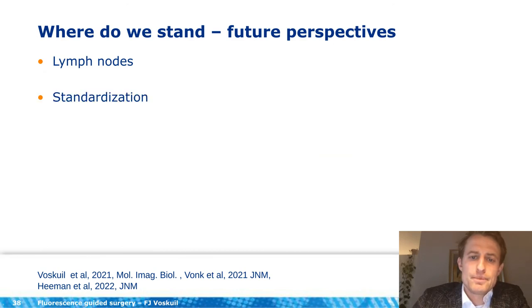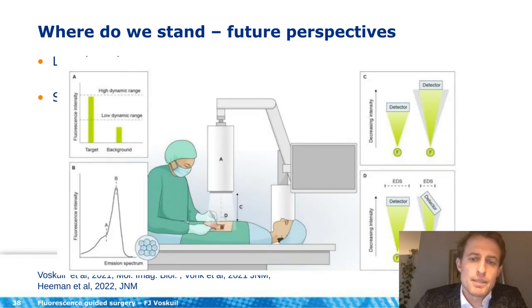We believe that standardization is key in our field. A nice paper to read on that is published by our colleague Heyman, also in the Journal of Nuclear Medicine. We know that the imaging results are largely influenced by the most stupid things, like the distance from camera to patient, the angle of the light, the environmental light at the OR, the detector head, the angle of the detector. So we believe that standardization is key to bring this field further.